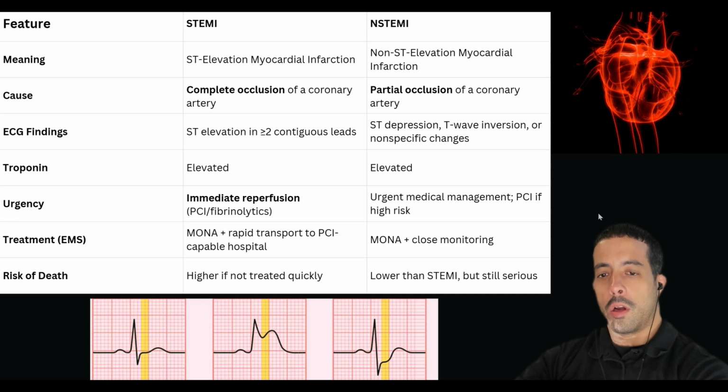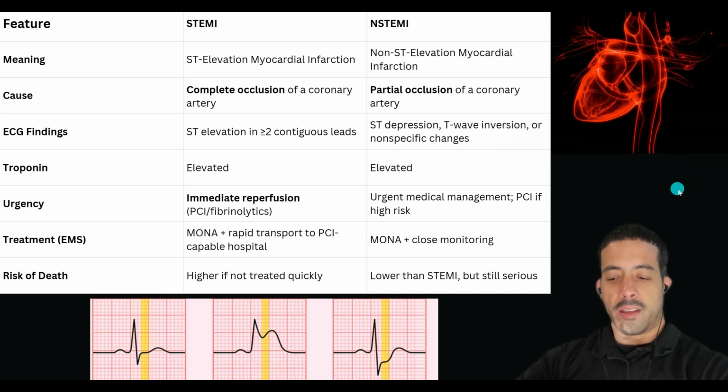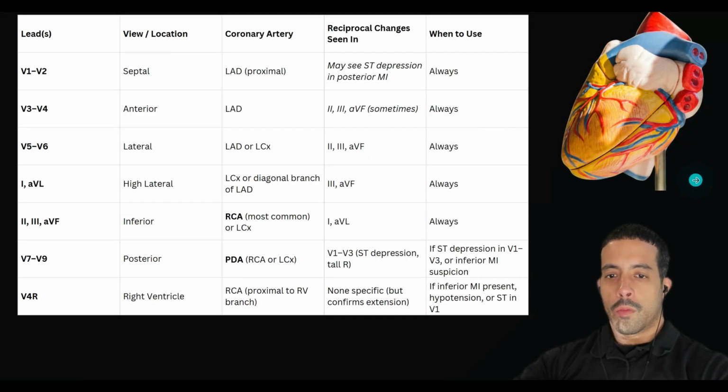Now, moving on to the next slide. This is very similar to what I just told you. V1, V2 septal, V3, V4. And another thing I want you to realize is that, as mentioned previously, there's a lot of things going on simultaneously. So another thing I want you to consider is what anatomical structures are being affected when a person has an MI.